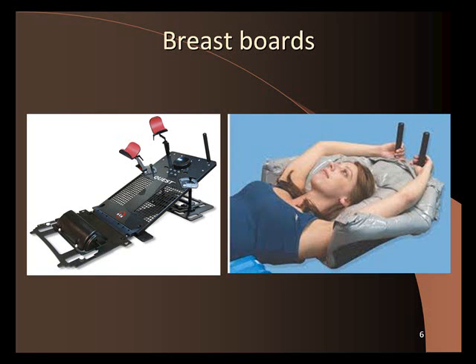Okay, so the purpose of this is to set the patient up the same way each and every day, and also to keep the patient from moving. And this is a different one. This stuff right here is called alpha cradle. Have you seen this? These bags. It's the vacuum sealed stuff, right? Well, there's two kinds. There's a vac lock bag, and there's alpha cradle.